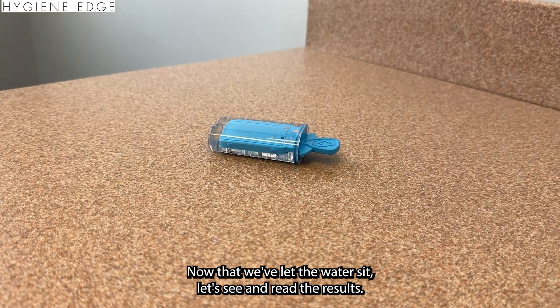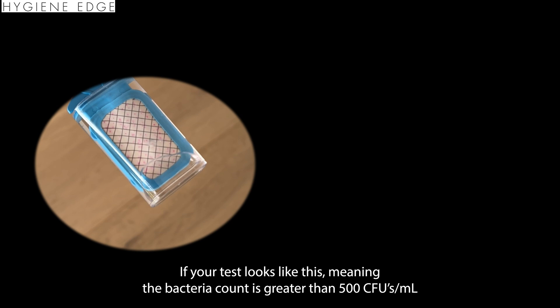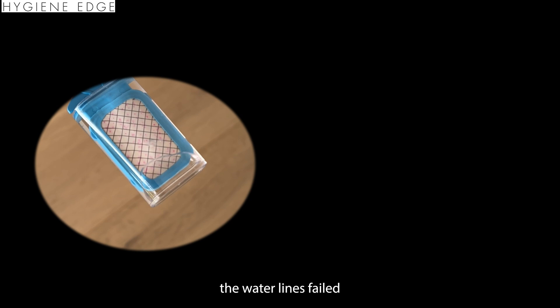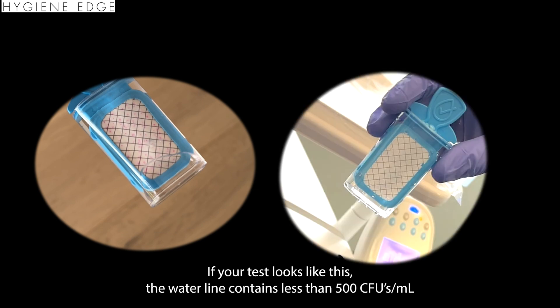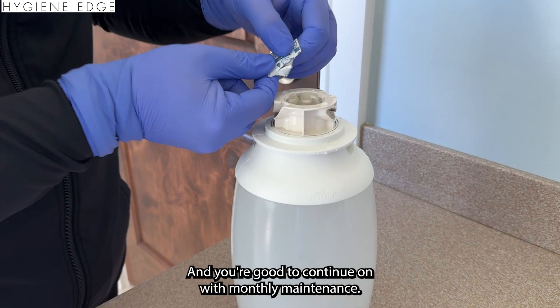Now that we've let the water sit, let's read the results. If your test looks like this — meaning the bacteria count is greater than 500 CFUs per milliliter — the water lines have failed and you're going to need to shock the lines. If your test looks like this, the water line contains less than 500 CFUs per milliliter of bacteria, which is required by the CDC, and you're good to continue on with monthly maintenance.